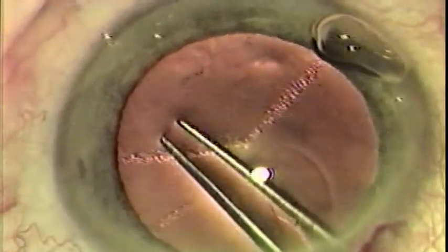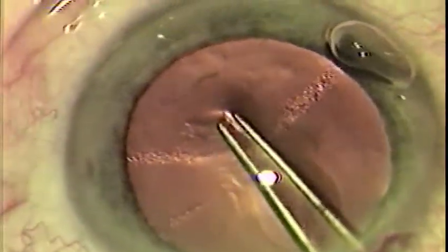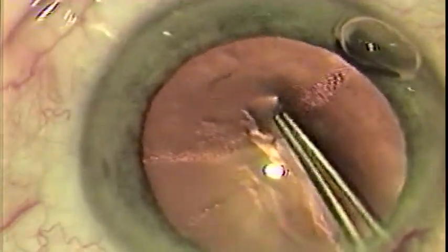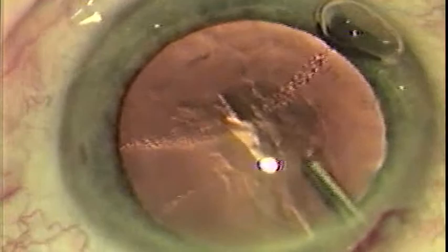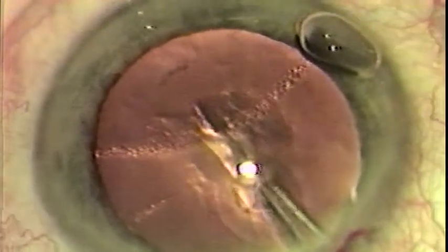Thousands of surgeons from all over the world have found the Kirchner One-Step Capsular Rexis Cystotome Forceps, manufactured by Rhine Medical of Tampa, Florida, to be effective in allowing them to open and complete the capsular tear with a single instrument.